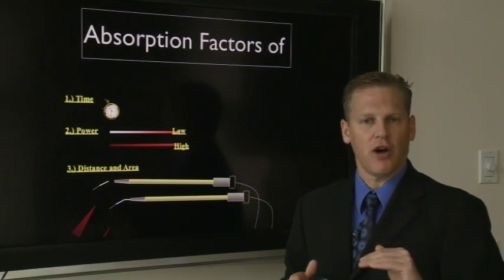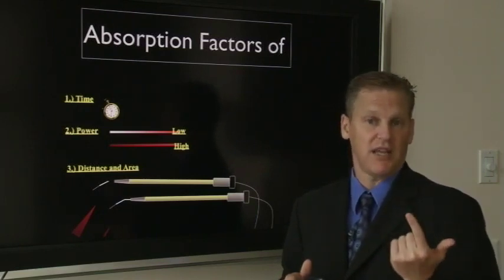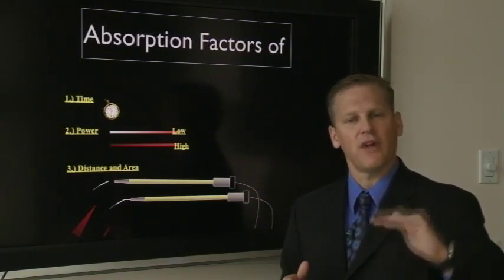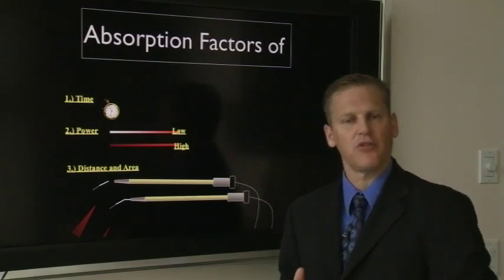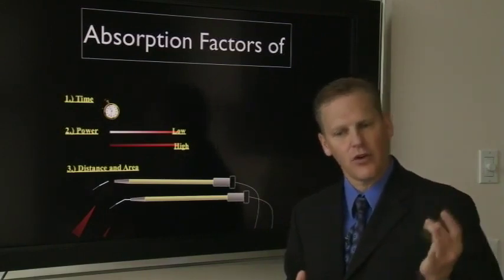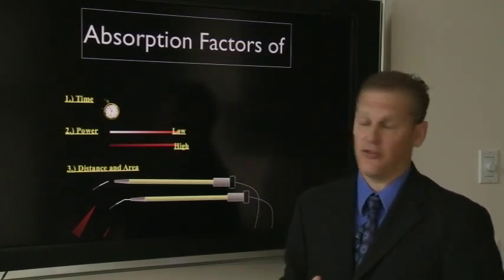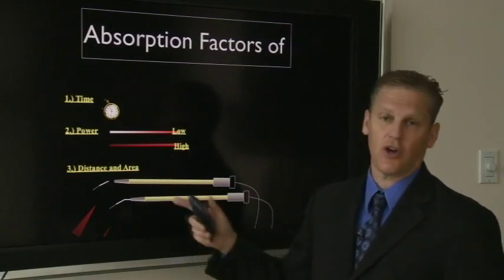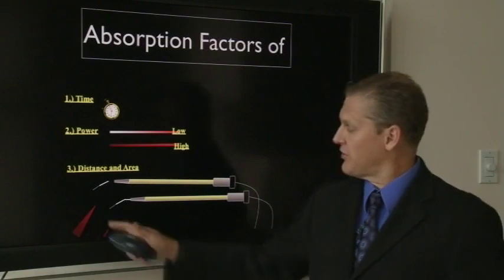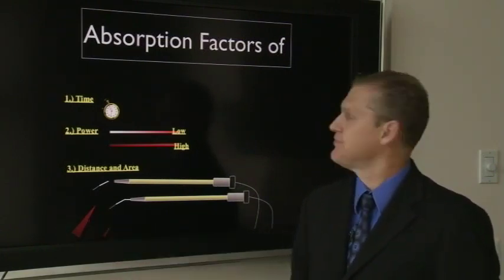If you are in non-contact, something like an aphthous ulcer treatment, controlling of bleeding, hemostasis, those particular items are in non-contact. You want the laser energy to penetrate deeper, so you will not initiate the tip. So the energy from the laser itself can go through the tip and penetrate deeper into the underlying tissue. So again, distance and area: contact means focused, and pulling away means defocused, and as you pull away, you will find that your beam goes from small to larger.